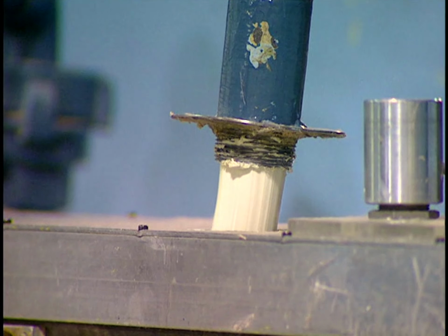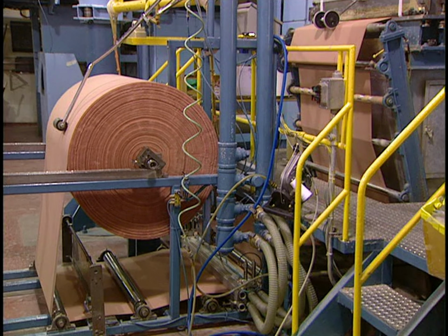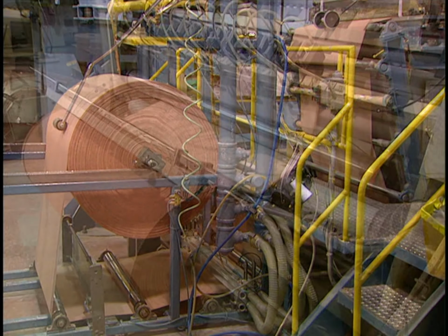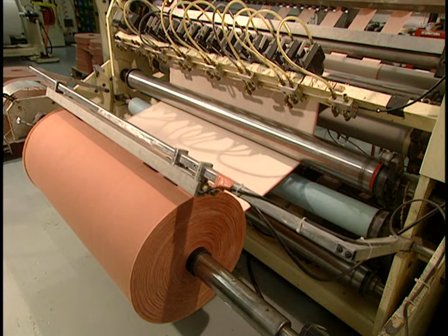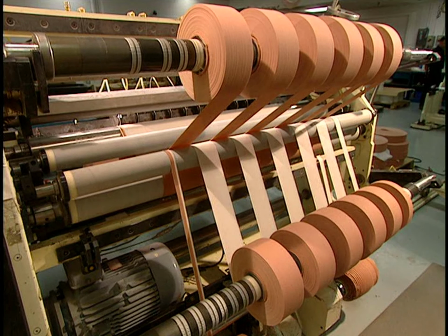A thin coating of glue is applied to one surface of the fabric. Then it's heated to 120 degrees in an oven to puff it up, creating holes in the glue coating. Then the fabric is newly rolled up into around 1,000-foot lengths.